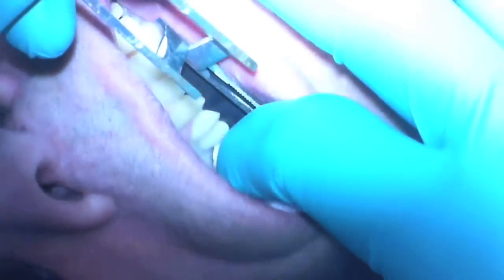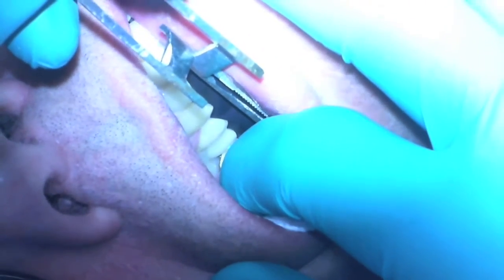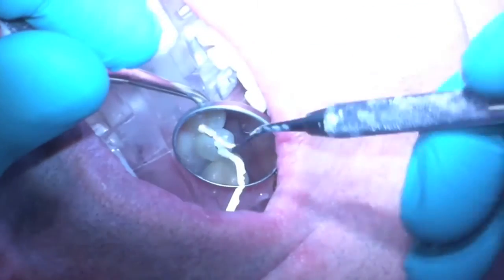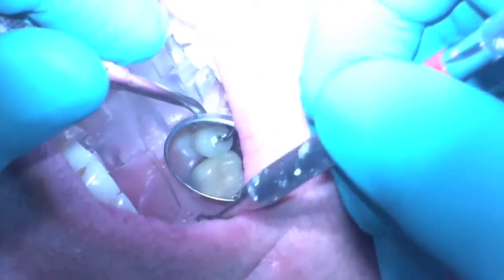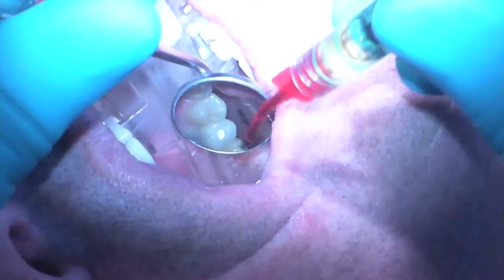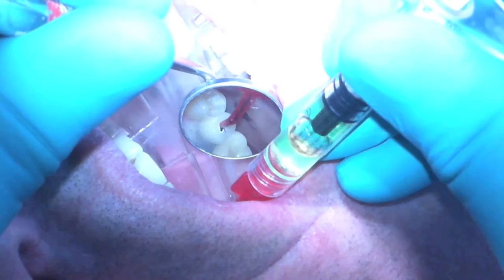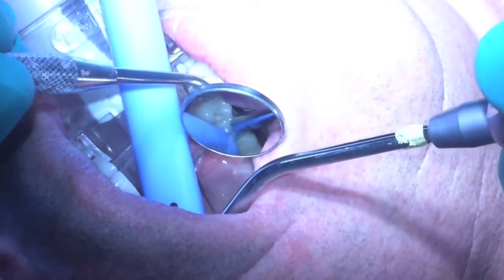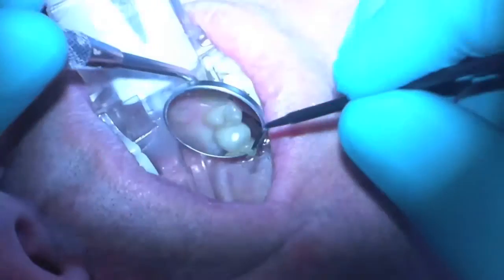One thing I like using is PTFE. It's basically plumber's tape, to fill in that little space. It creates a nice seal, but it's also so easy to work with. If you ever have to go back in there and take it out, you just pick up on it, and the whole thing peels out of there. So I'm a big fan of that as well. Again, I'm bonding my composite into the surface of it, into the access hole.